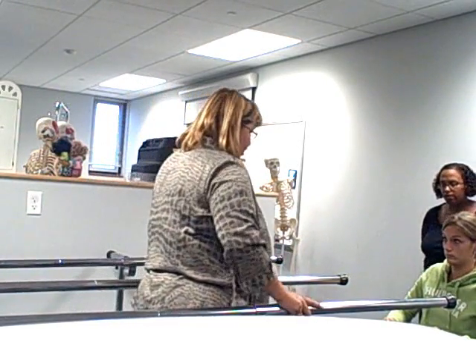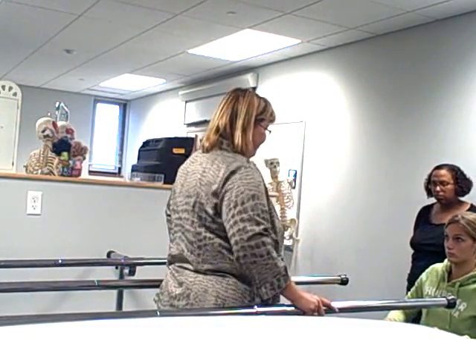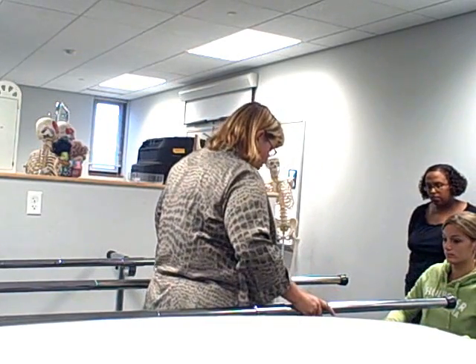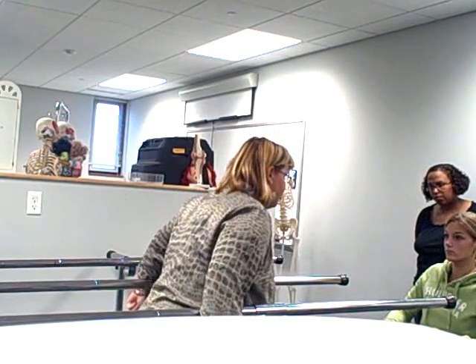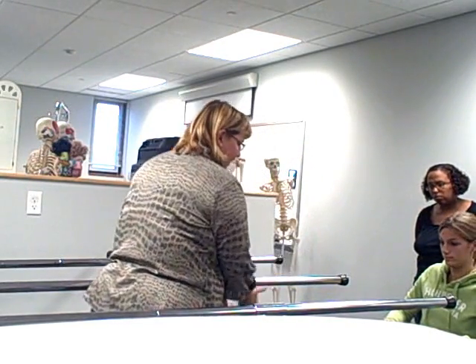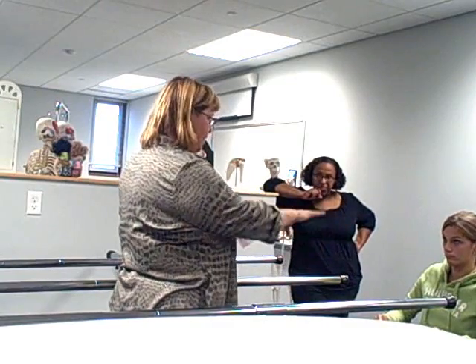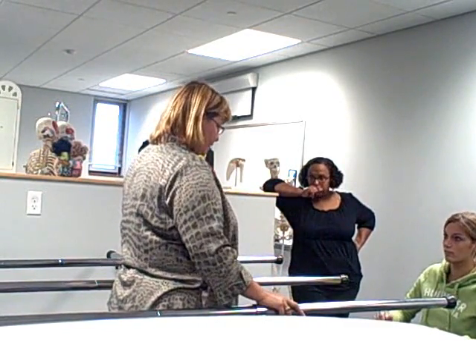So when you get to the wheelchair, you're going to do the same thing — turn in this direction. You'll take your sore leg, put it forward, lean your shoulders forward, and reach for the armrests. Then you'll sit on the front of the chair. Then I can help you with your leg when you switch back. So we're going to get up, walk to the end, turn toward your strong side, come back, turn with your strong side toward the chair, and have a seat.